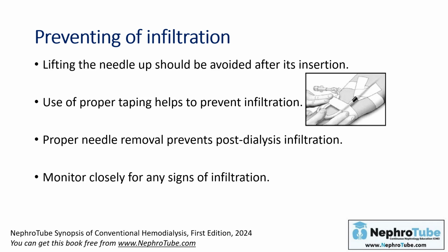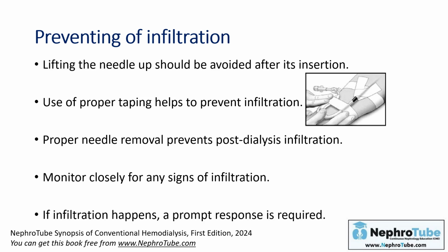Then you have to monitor closely for any signs of infiltration. If infiltration happened, rapid response is required, and I will talk about how to respond to infiltration later in the coming lecture when we will talk about complications of AV fistula.